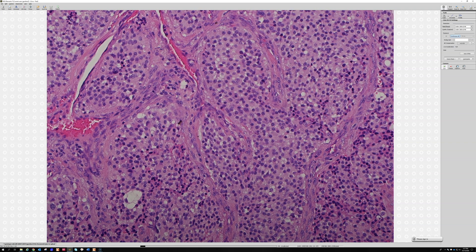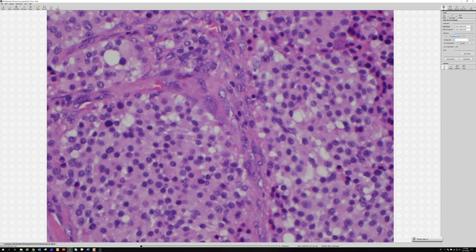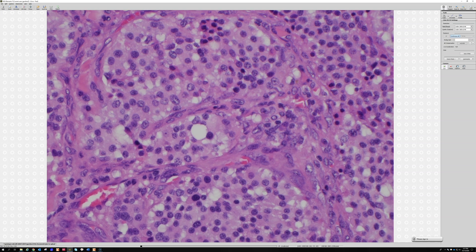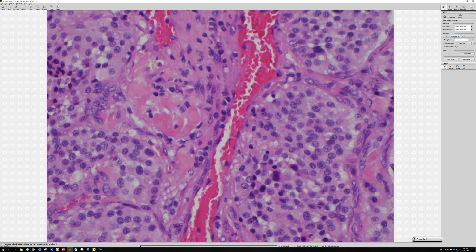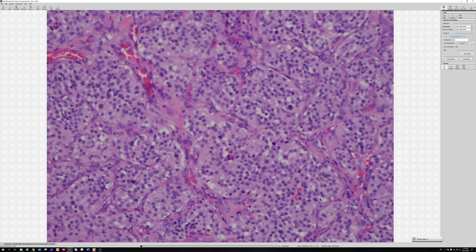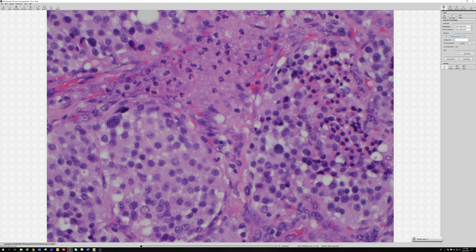Here are the nice nuclear features. You get a salt-and-pepper stippled neuroendocrine-type chromatin — that very small speckly-looking chromatin. And like with other neuroendocrine tumors, you'll often have random pleomorphism: random large nuclei scattered in the midst. That's a very helpful feature — the neuroendocrine look with stippled chromatin and randomly atypical cells.